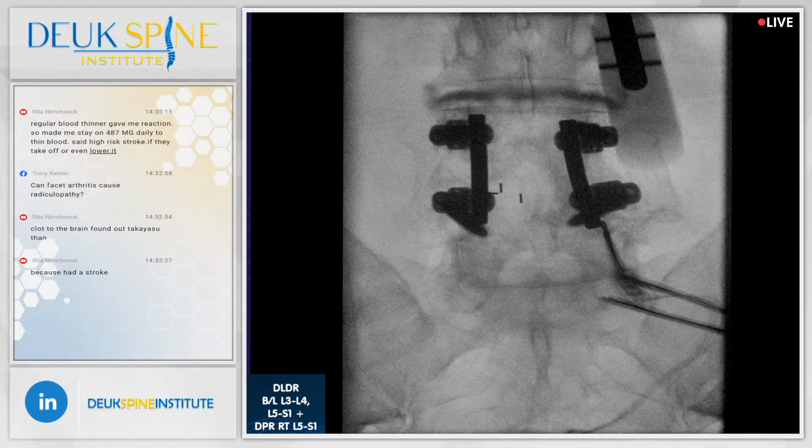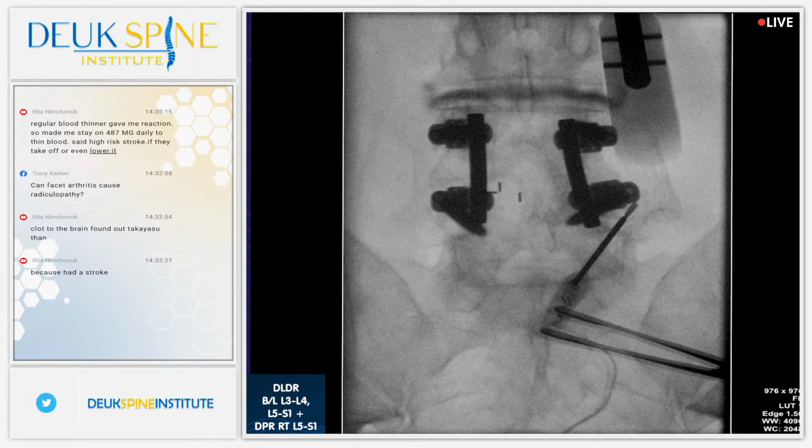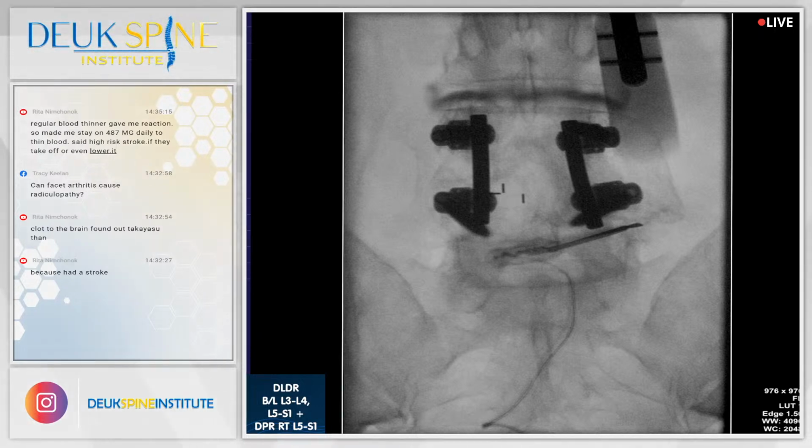Shot. So the first thing I have to do is get to the L5, which is a little bit to the side here. The L5 transverse process, and where it connects to the superior facet. It's just below where I'm at. You guys see that? Yes, we do. Shot. I need pressure there. Pressure right here. Give me a second.